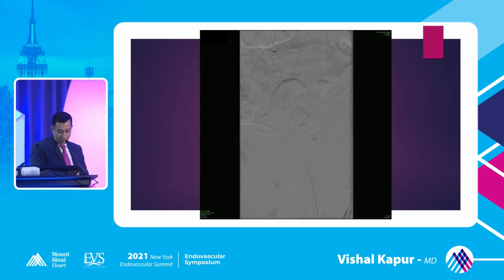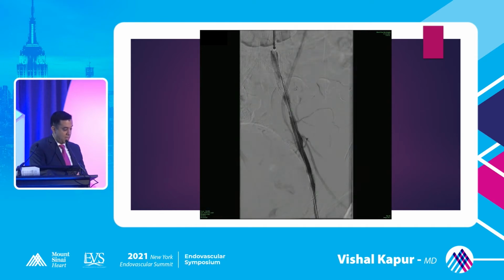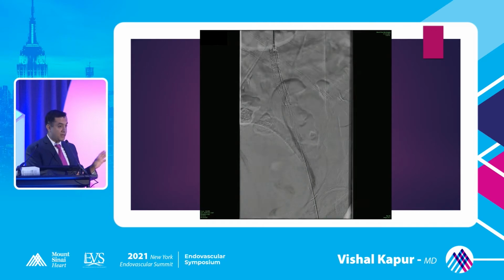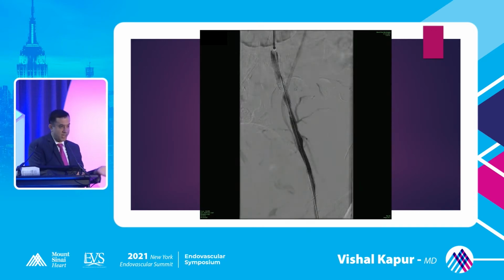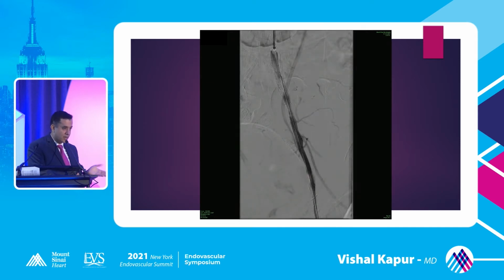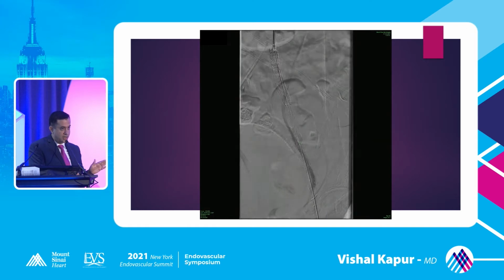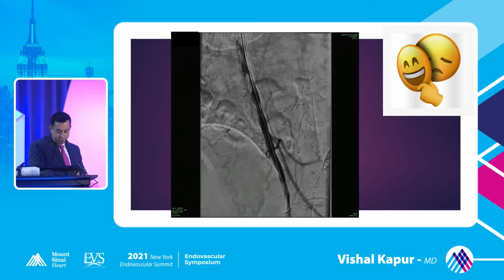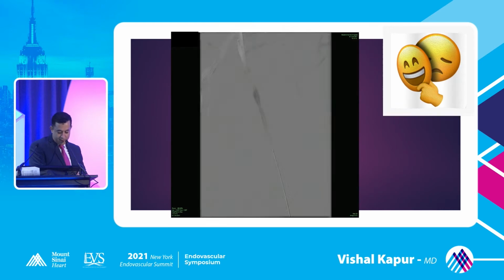But the biggest problem is the clot sitting right there now. Usually the teaching is you will reverse your anticoagulation. We just repeated the ACT for documentation purposes. It was like 218, 221. So it wasn't that crazy high, but it wasn't that crazy low either. We didn't give any protamine because the patient was stable, the perforation had stopped, and now we're stuck with this clot. So you take some pictures and it's sitting right there.